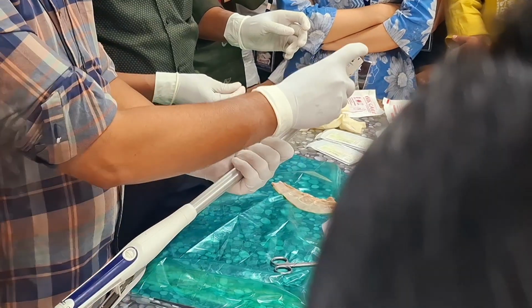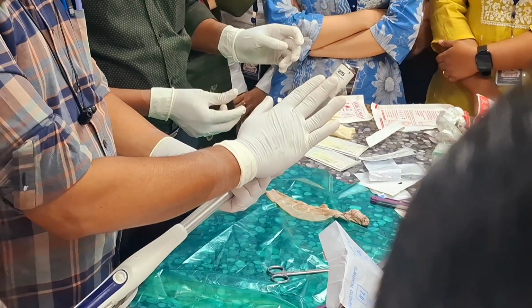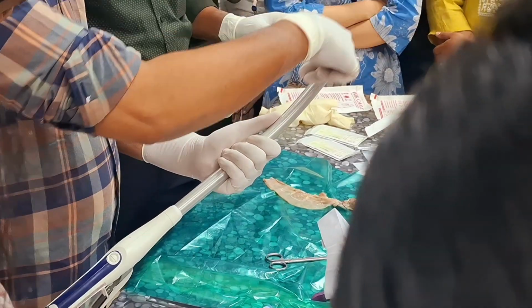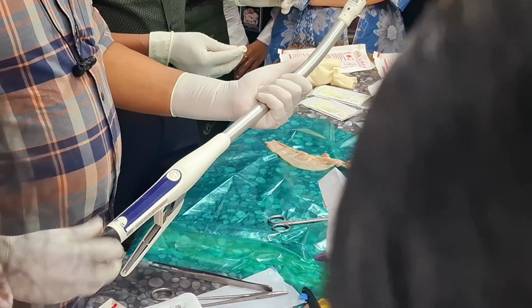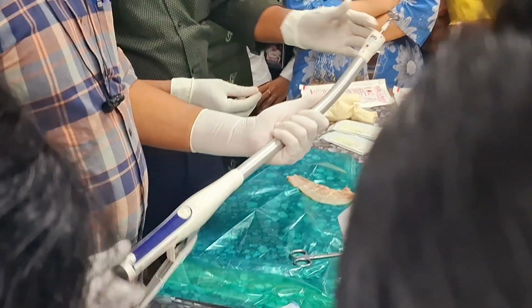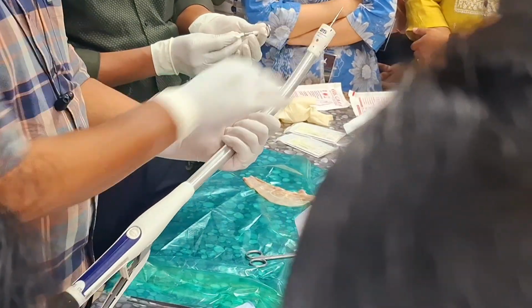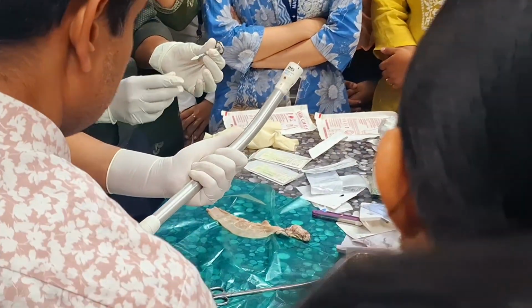So you will have one end which has the pins and one end will be the base. The pin comes from here, goes, comes back. And this should be detached. So it gets detached there, and this is again retracted.